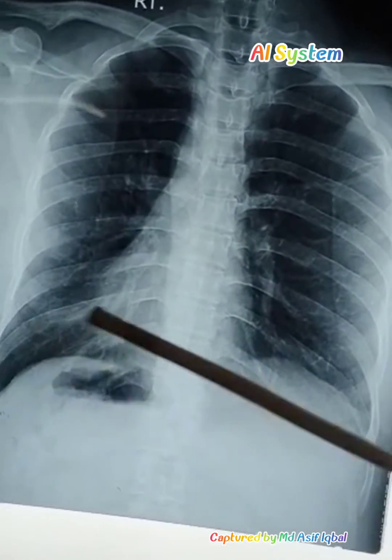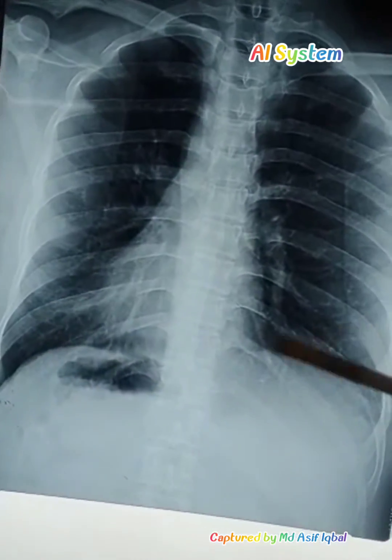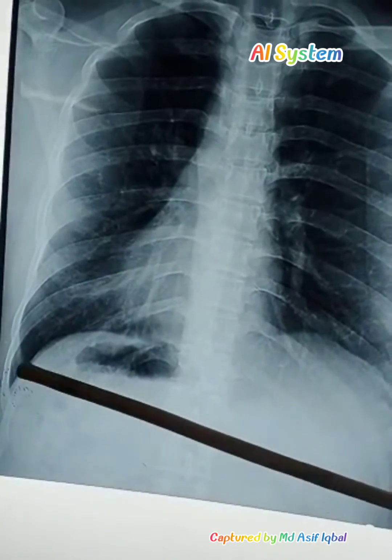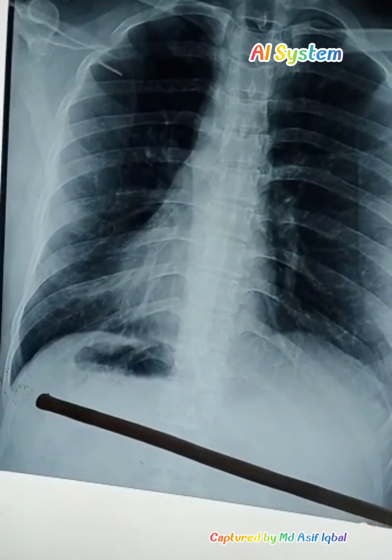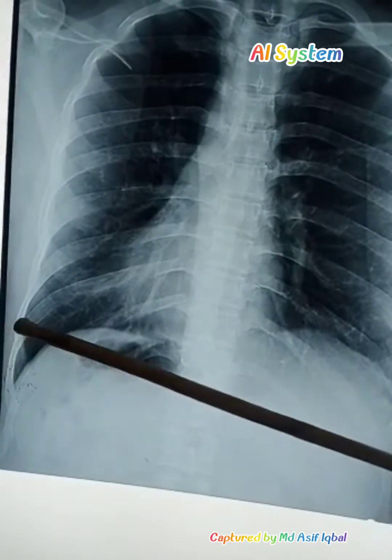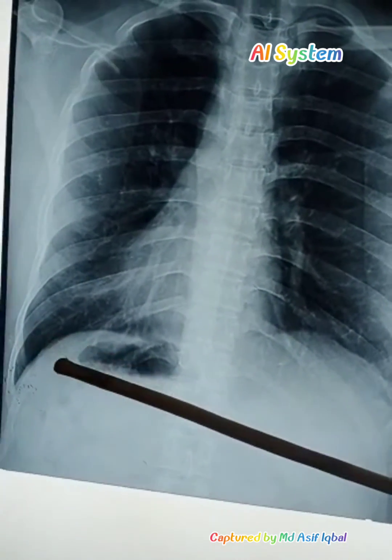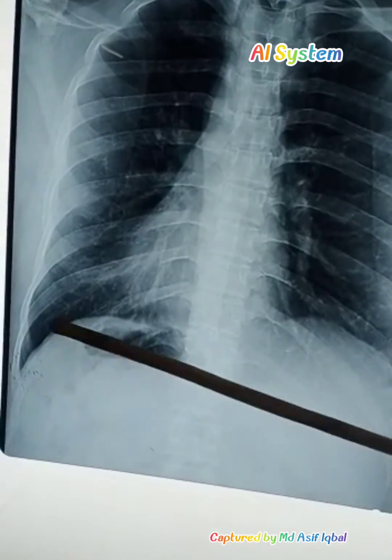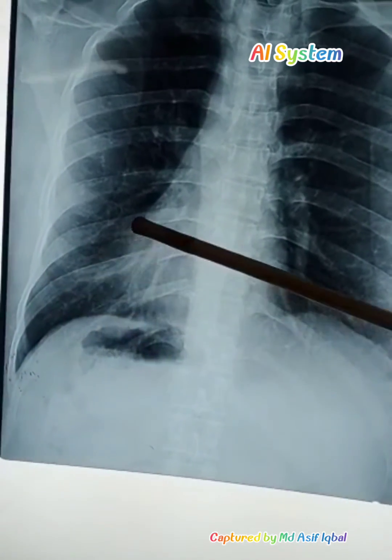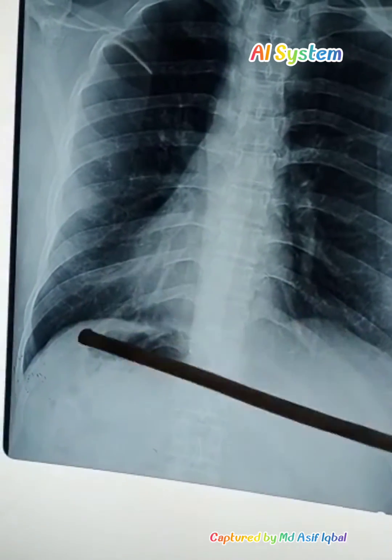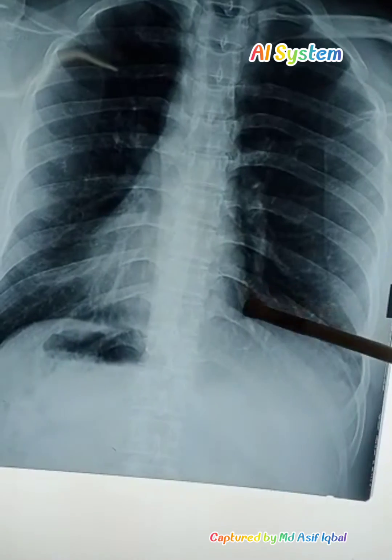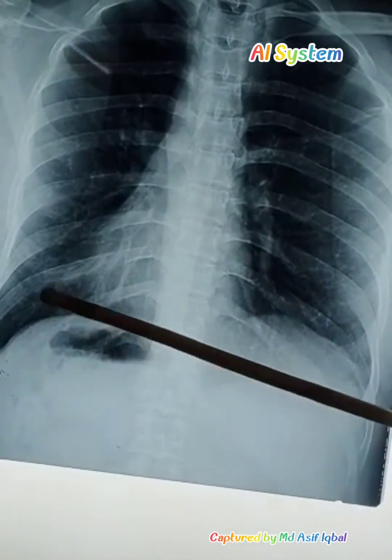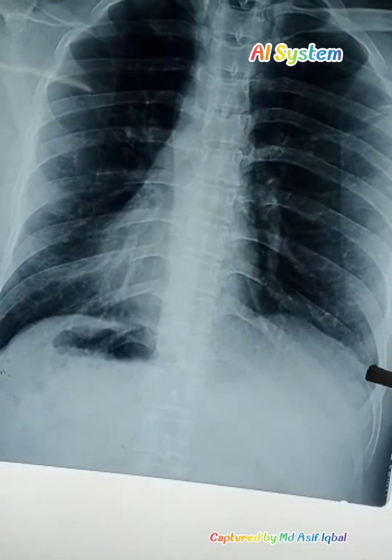There are two angles present in the X-ray. This is the costophrenic angle, and this is the cardiophrenic angle.